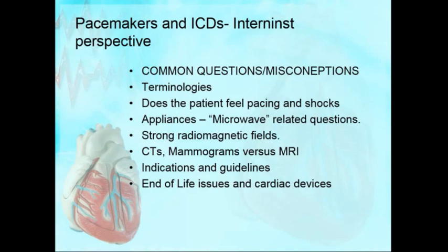Okay? Also remember this, if somebody has a pacemaker and the pacemaker battery dies and you're going to put a new battery in, you say, well, why don't we put a new battery which is MRI safe and this should be okay? Just a clinical question. Those wires are stuck. You're not going to change the wires. Those wires are not MRI compatible. So you can put an MRI can, but the wires are out.